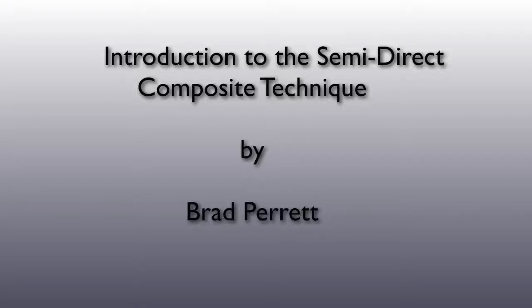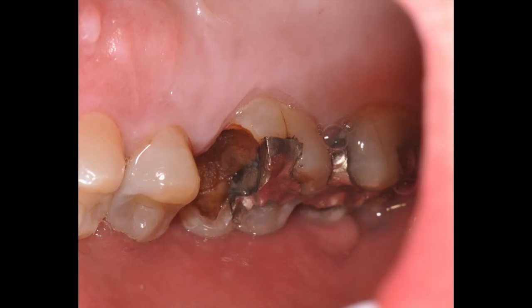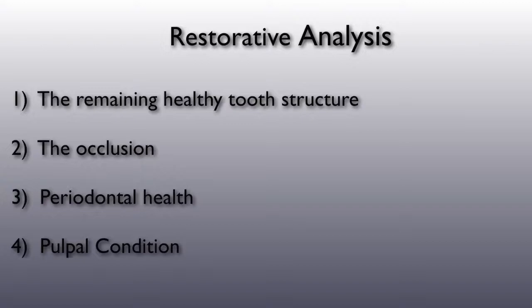I want to introduce you to the semi-direct composite technique. I have found this technique to be very useful in cases with extensive decay in which I do not want to remove healthy tooth structure but need to provide a restoration that will replace the lost tooth structure and return the tooth back to function. In this case study, we will be looking at tooth number 3, which exhibits extensive decay.